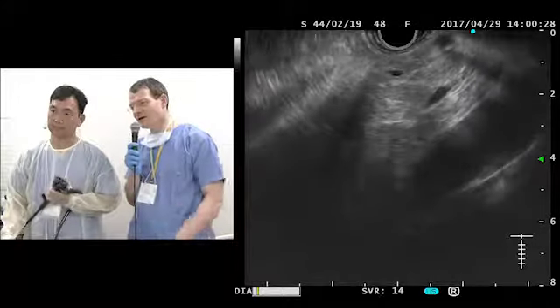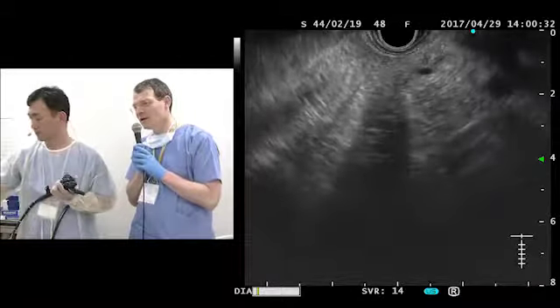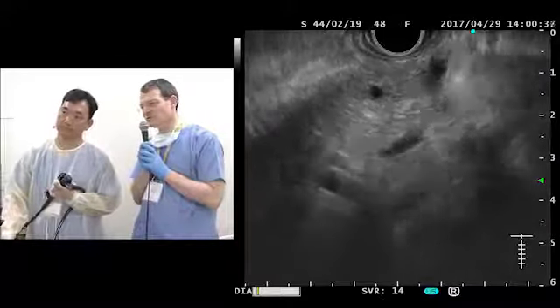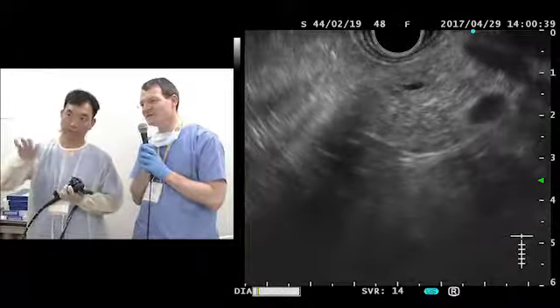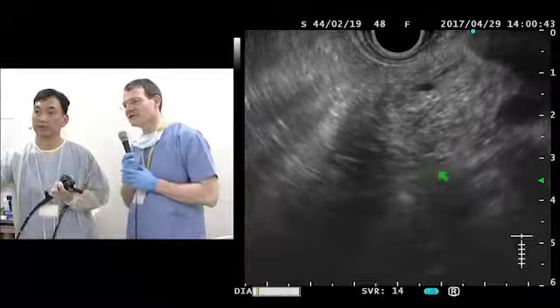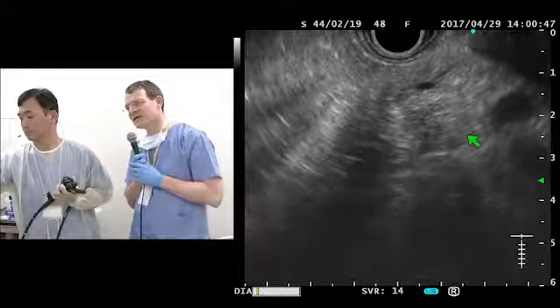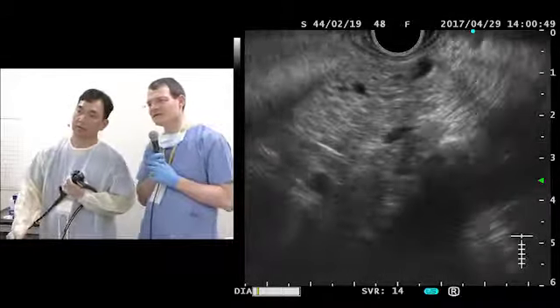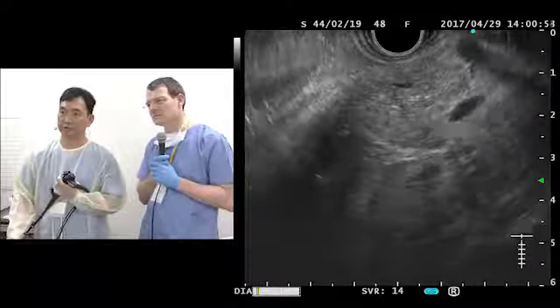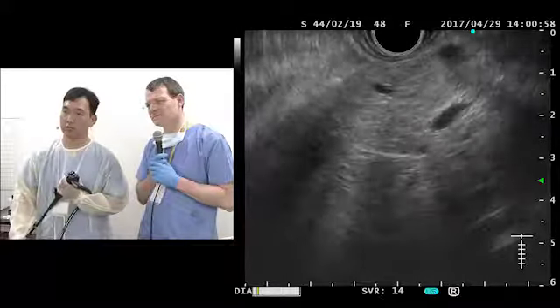What do you think of the lower part of the pancreas? There are some areas now which are a little bit more echo-rich, and you have such shadows. Below the pancreatic duct, yes, here. I agree with you. There's some increased septal stranding, but there's no hyperechoic foci.